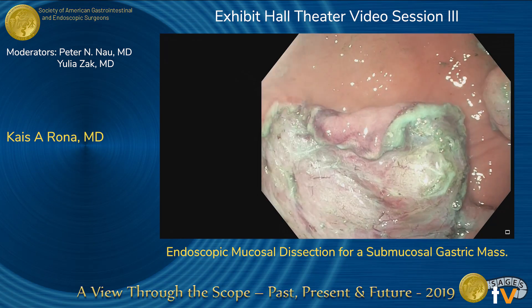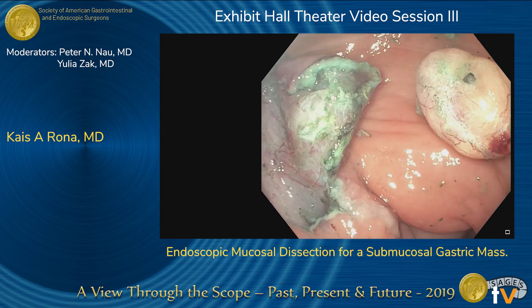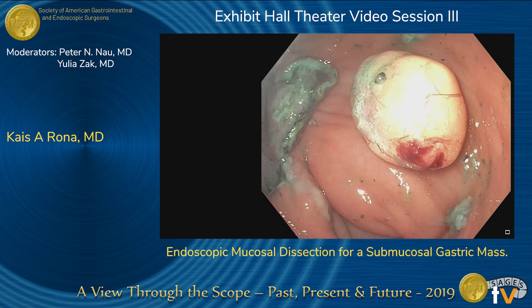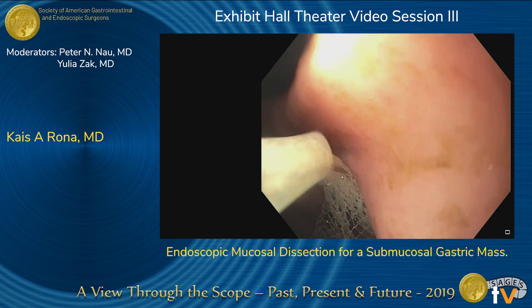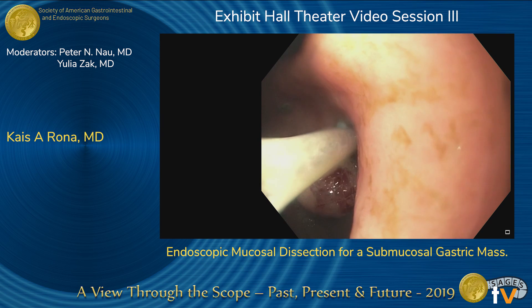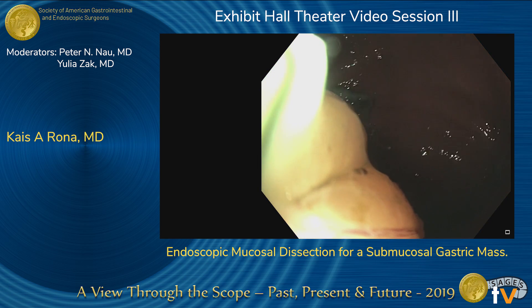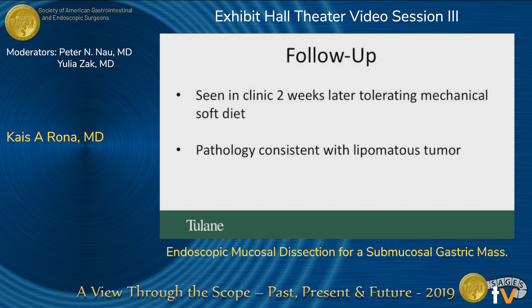Once it's completely detached, we use an endonet to remove the specimen from the gastric lumen. We tried to close that mucosal defect, which proved a little more difficult than imagined. If it were in the esophagus, you definitely want to close those defects, but in the stomach you can leave it. The patient did excellent postoperatively with no complications — discharged on postop day one tolerating a clear liquid diet. We have a protocol using PPIs and carafate.